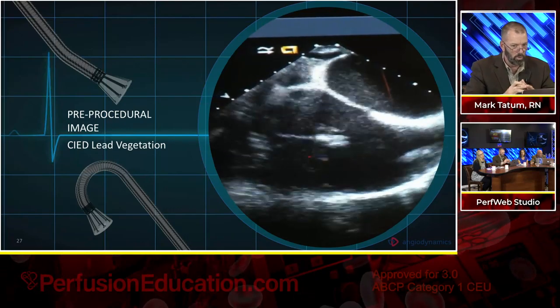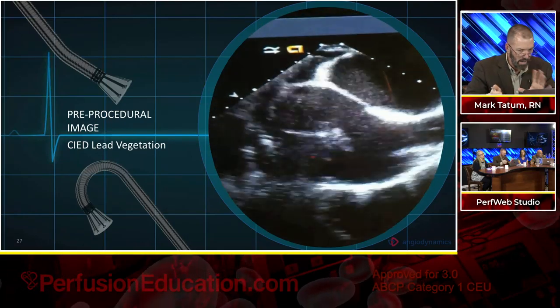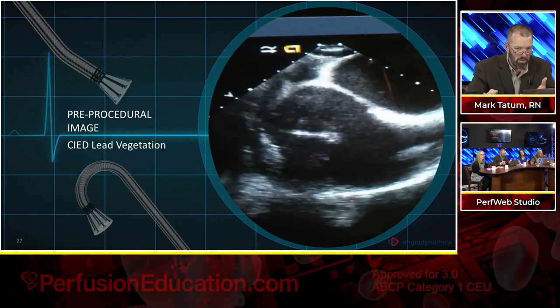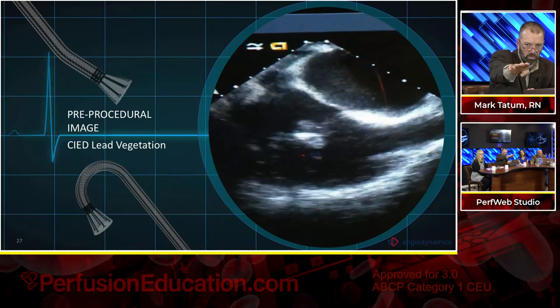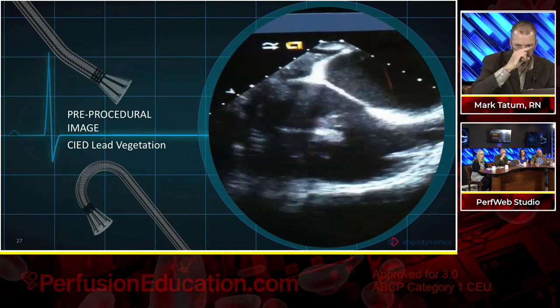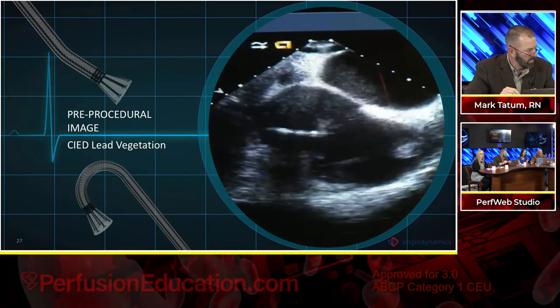Now, obviously, this is blown up a little bit larger, but if you had to make a size estimate from this, are you going to say this is half a centimeter, maybe a centimeter, using your markers over on the side, knowing that each one of those is a centimeter? What are we going to do? Yeah, I think it's hard to tell on a single plane. I'm so glad you said that, Joe.